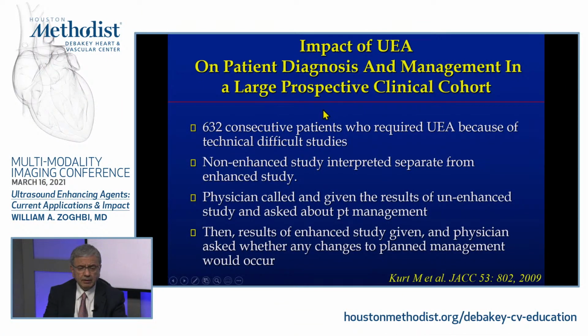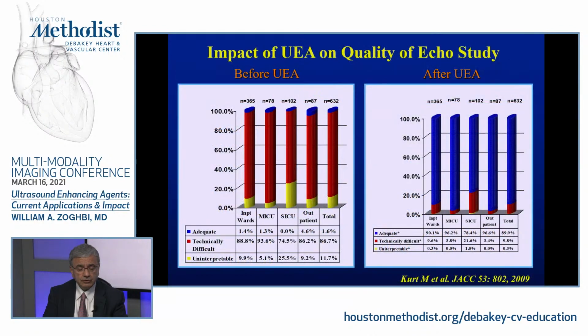We took 600 some consecutive patients who required enhancement with contrast because of technical difficulties, did the study and contrast towards the end, and we called the physicians with the report of the unenhanced study and asked them what they would do, and told them what the results were after we interpreted the enhanced study with contrast, and see how they would change their management.